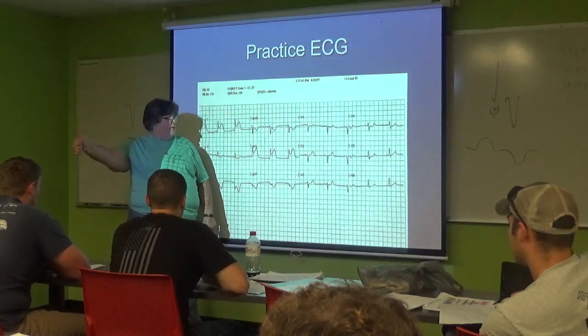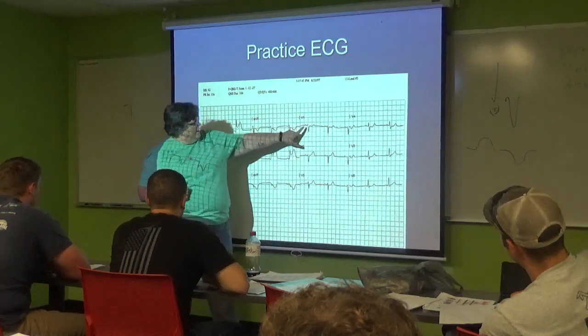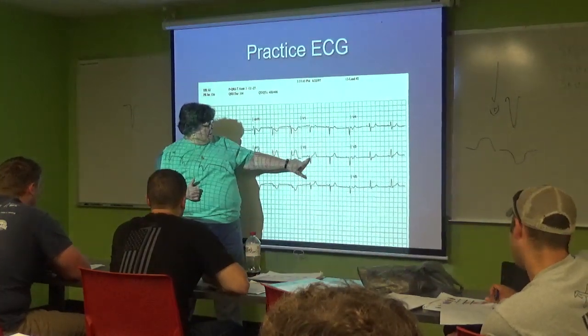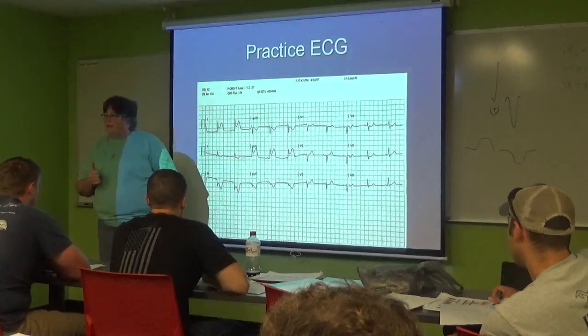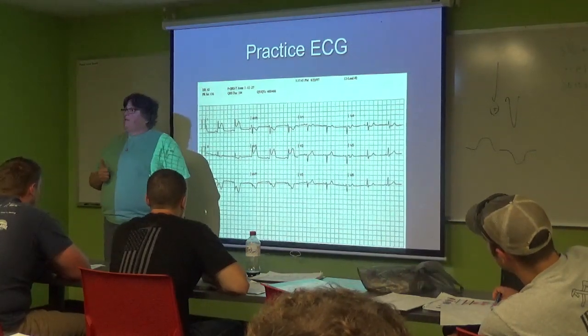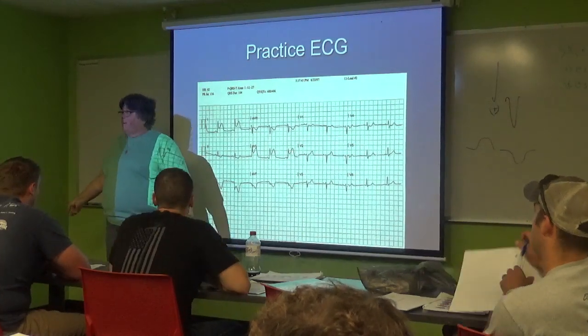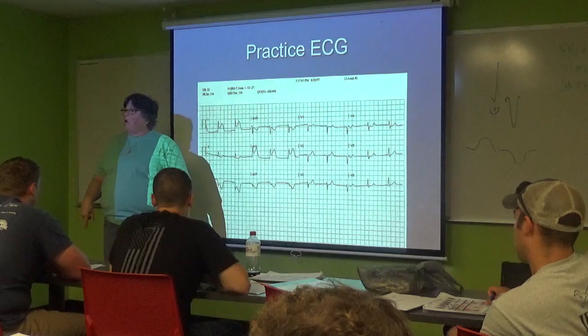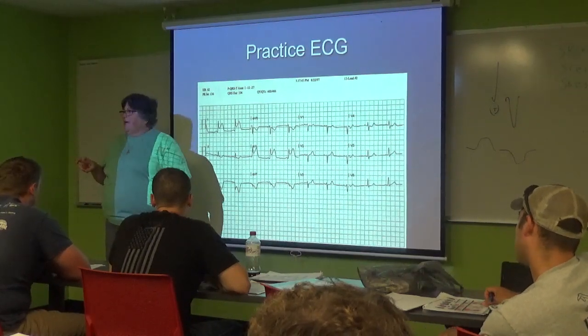But I gotta finish. I need septal leads. V1, no elevation. V2, no elevation. When I'm done with all of my leads, I then say, what kind of an MI is this? This is a high lateral wall MI. Now, people talk about, what are the reciprocal changes?